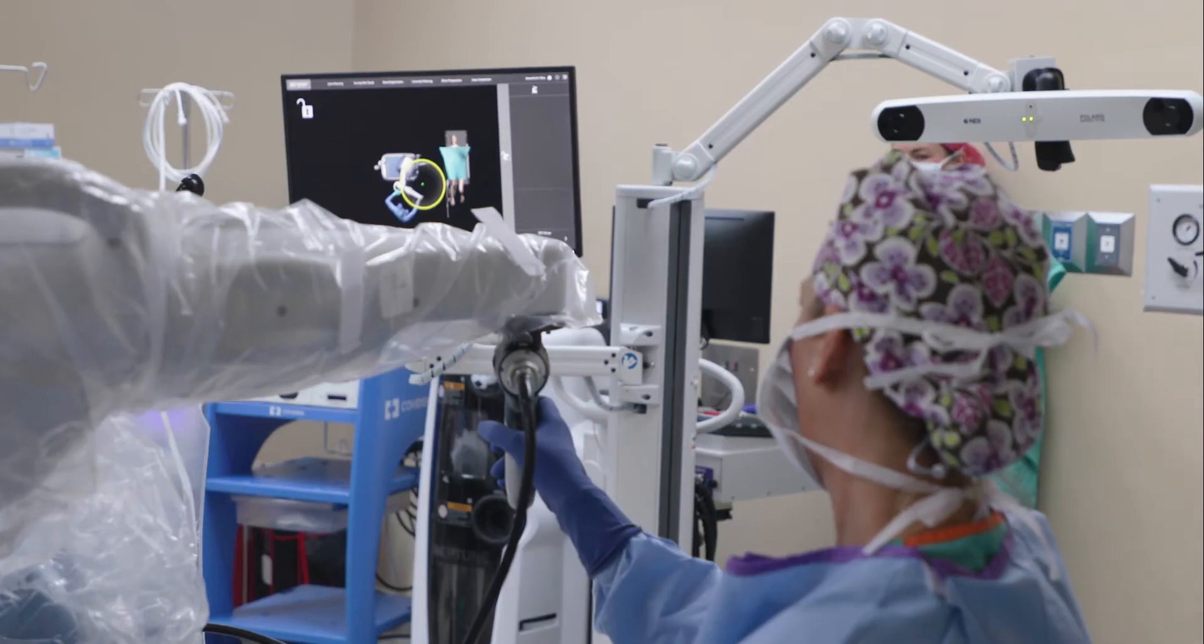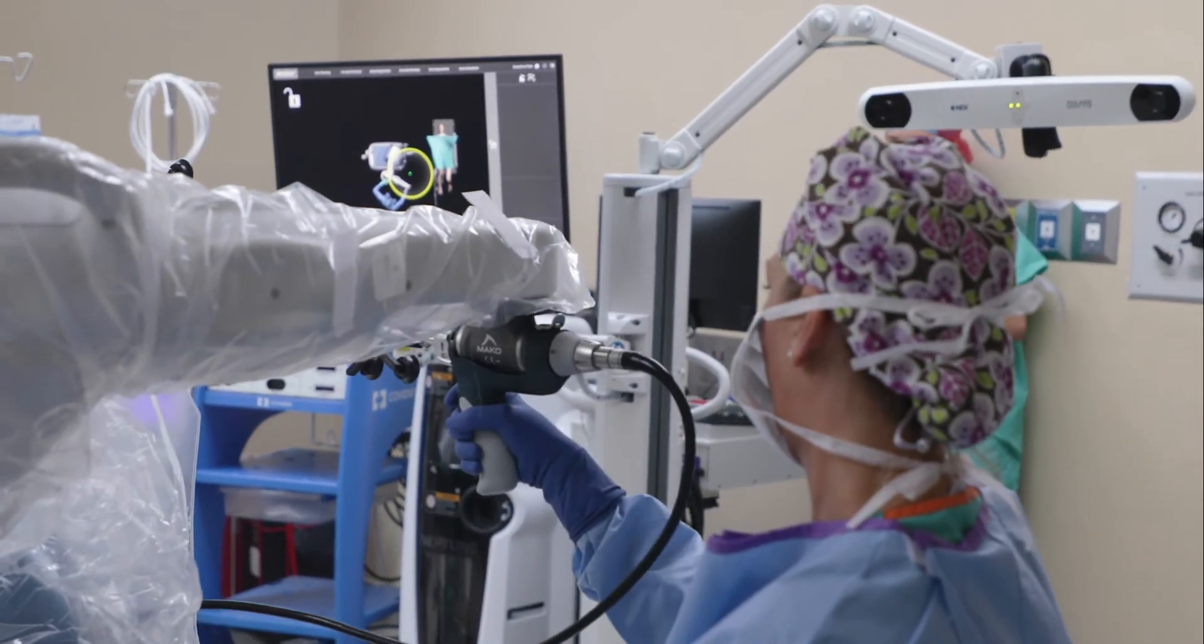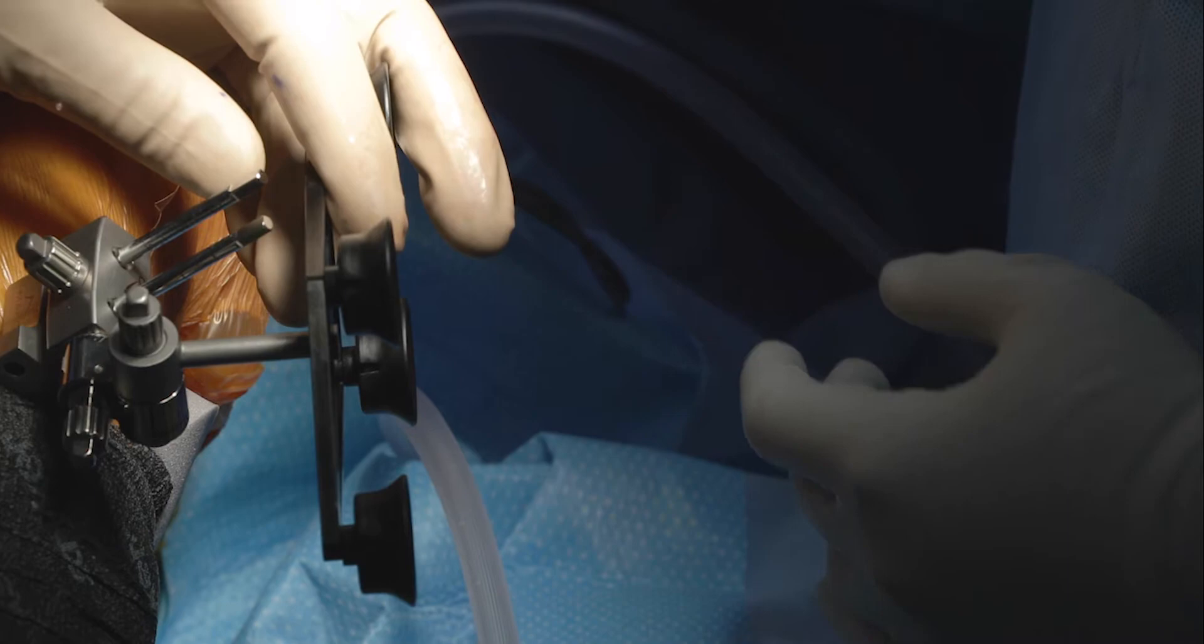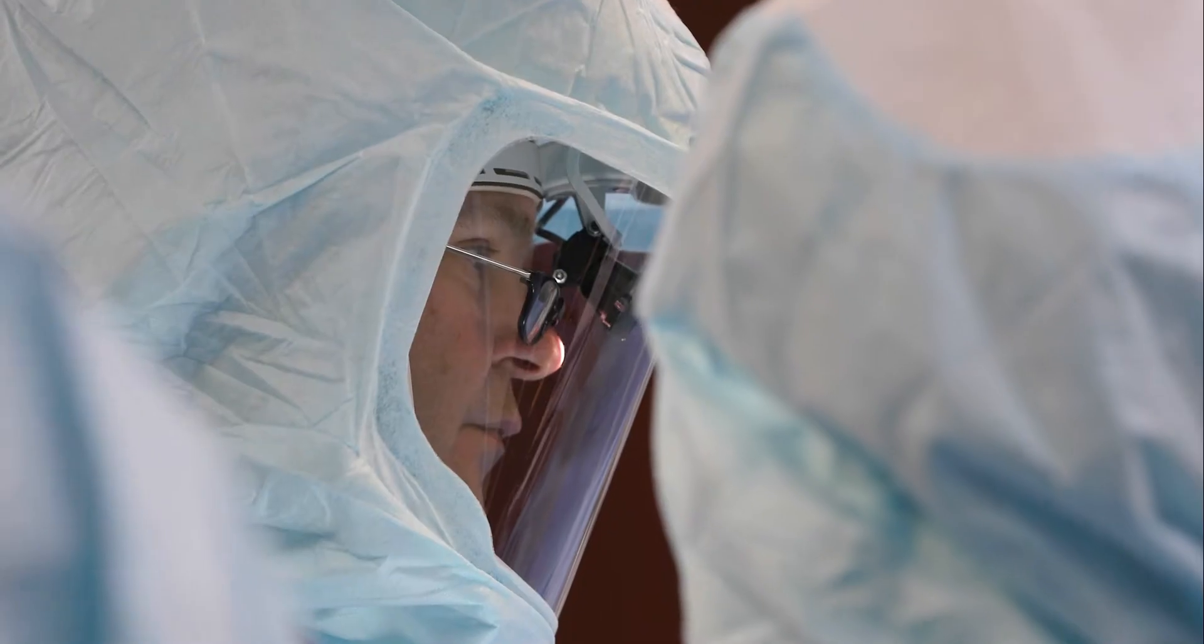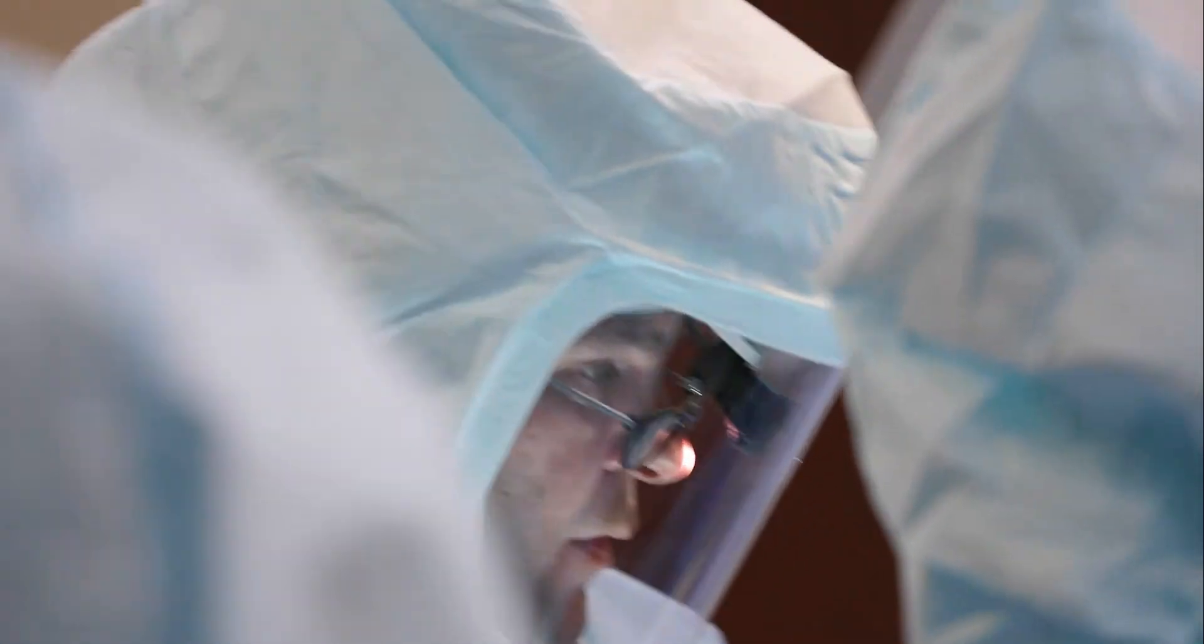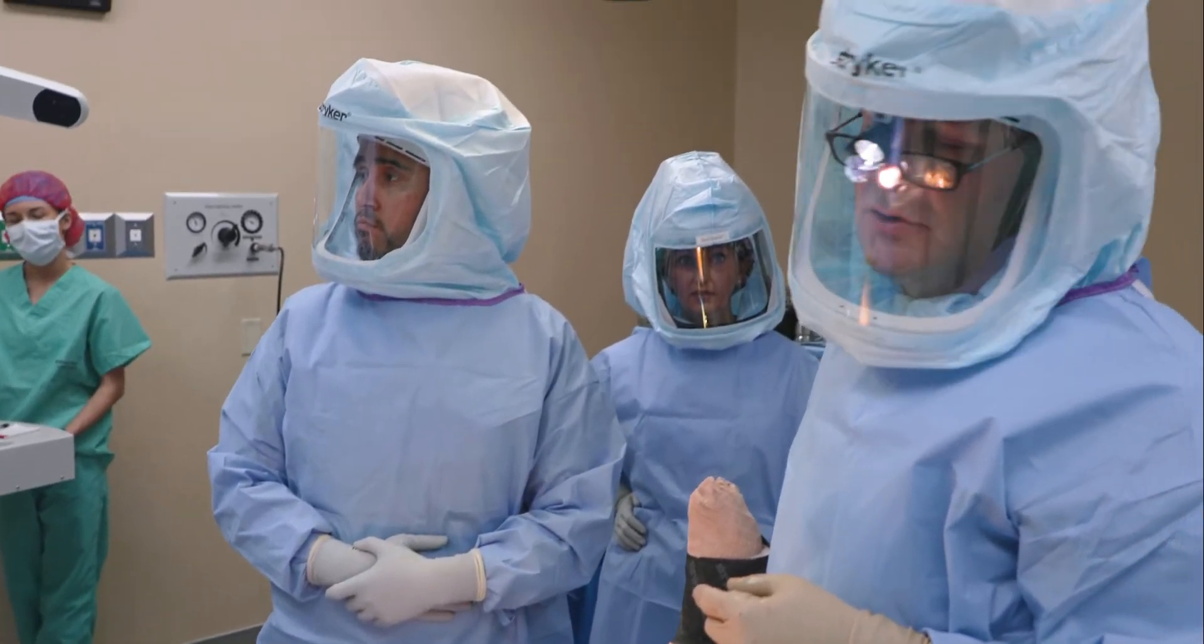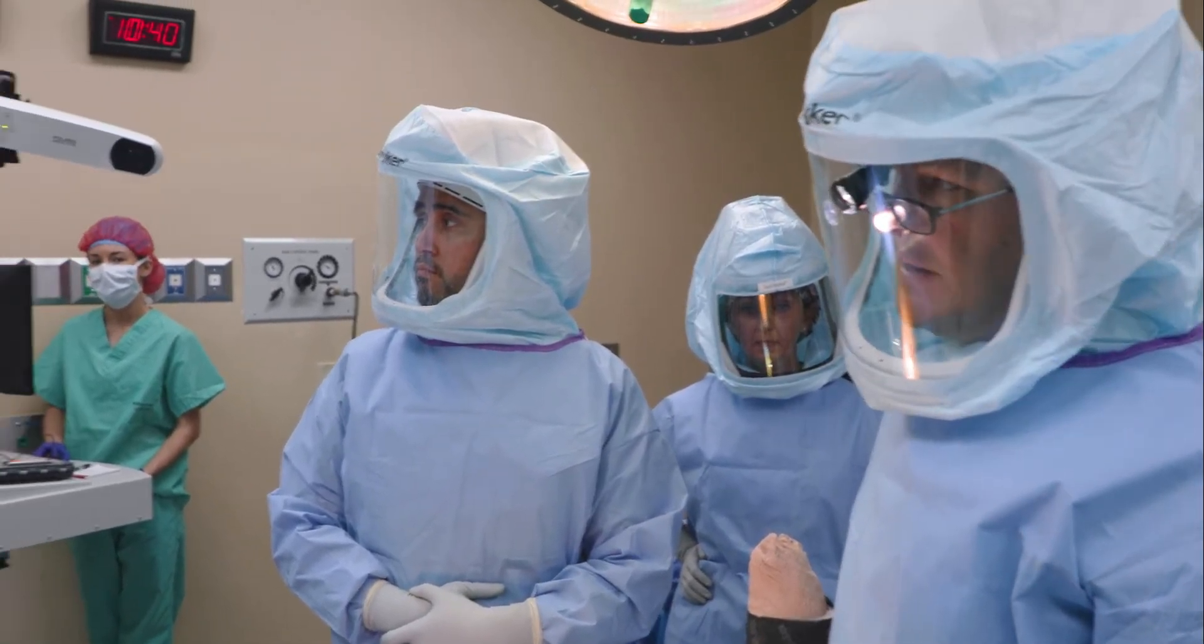Literally, that robotic arm follows the knee, so even if you move the knee a little bit, it moves with it. The robotic arm helps you prepare the joint, make the cuts, and perform the specific surgical maneuvers essentially perfectly.